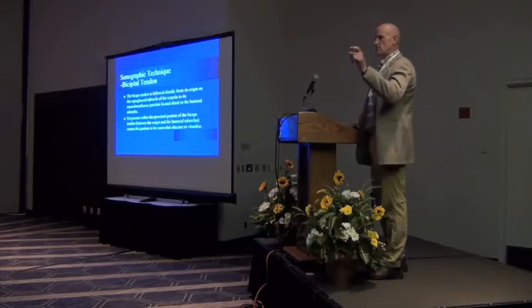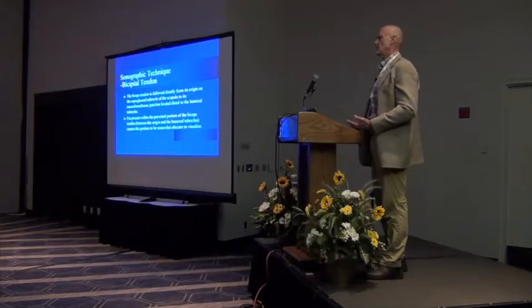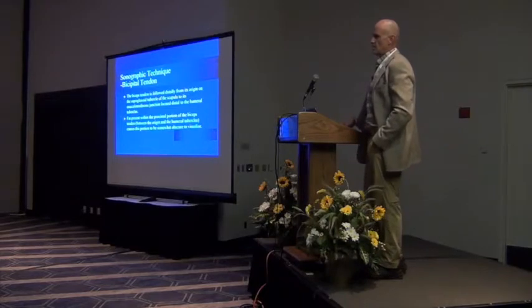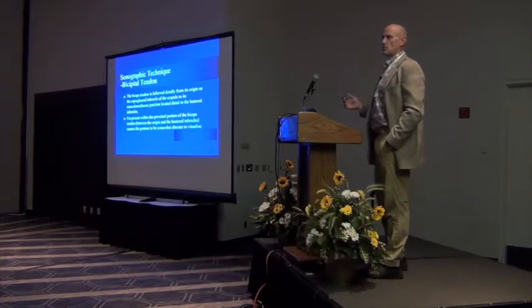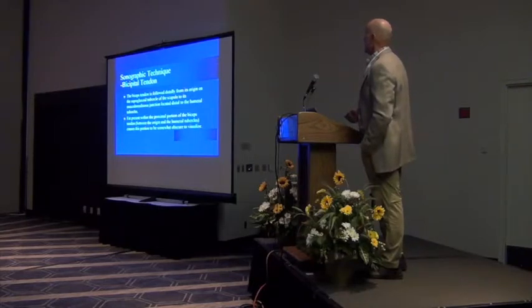It's usually short focus. I personally like to use the highest frequency ultrasound probe I can use. And I don't feel that some of my microconvex gives me as good an image as the linears that we use. And linears are, I've got a 10, I've got a 14, and I've got an 18. And I just choose which probe is going to give me the best image of the structure that I'm looking at.